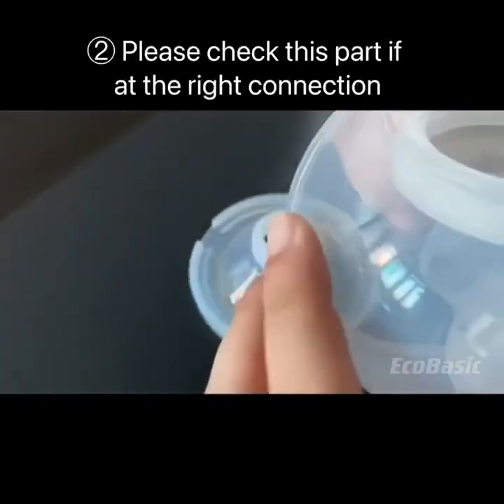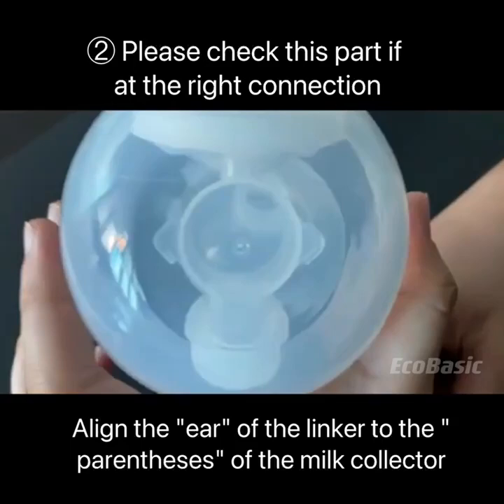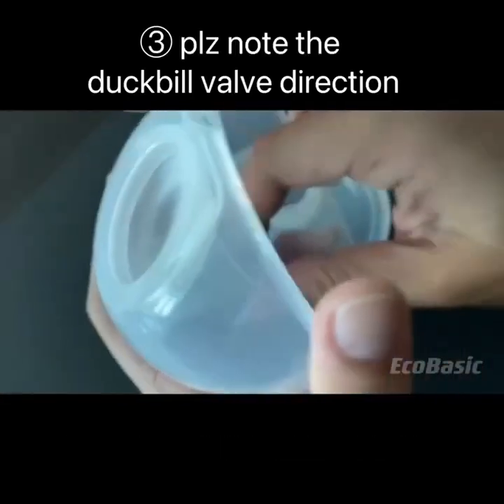Next, please check this part is at the right connection. Now it is wrong. Align the ear of the linker to the parentheses of the milk collector. It's in the correct position now.